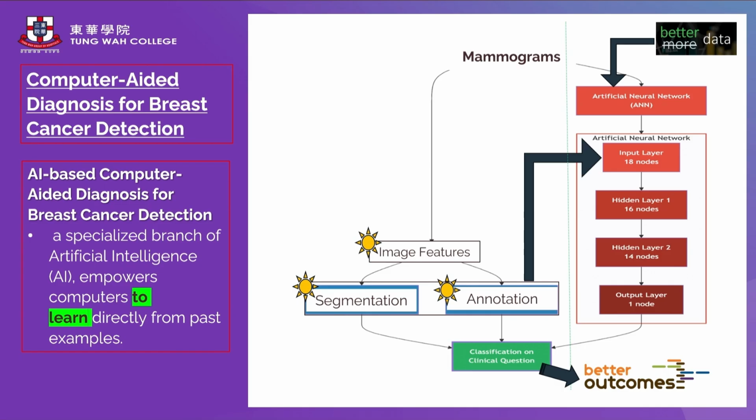And then how you tag or label the image features with meaningful labels. And last one, before the image features can be extracted, we use some methods to process the images before we feed them into the AI models.